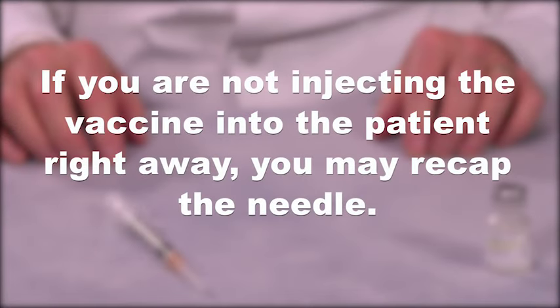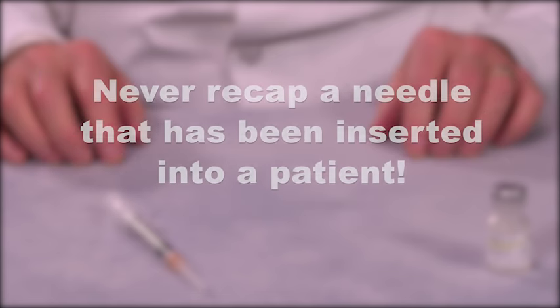If you are not injecting the vaccine into the patient right away, you may recap the needle. At this point, it is okay to recap the needle since it has not entered a patient and is still sterile. Never recap a needle that has been inserted into a patient.